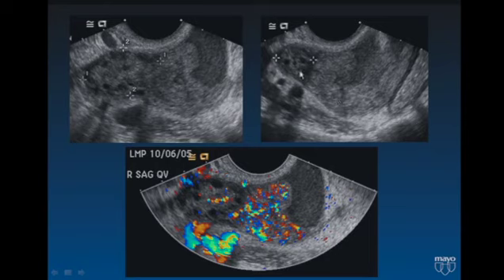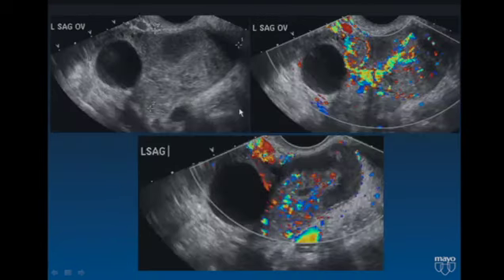So, for example, in this patient who had suspected inflammation in her pelvis and has an ovary that is still recognizable as an ovary, but starting to merge into a heterogeneous, hyperemic, para-ovarian, somewhat tubular configuration structure. This is what one would term a tubal ovarian complex. And in this patient, who also has an ovary, as we can see with 1, 2, 3 small follicles, and a dominant physiologic cyst, but whose ovary is now less well distinguished from the inflammation that's occurring in the para-ovarian tissues and the mesosalpinx, has what is becoming a TOA.